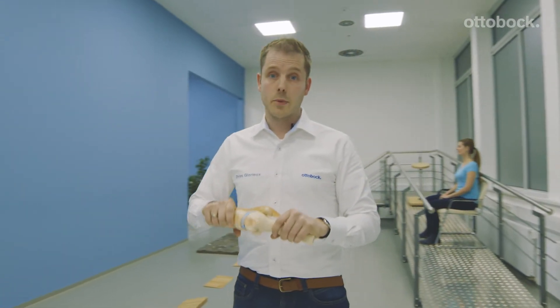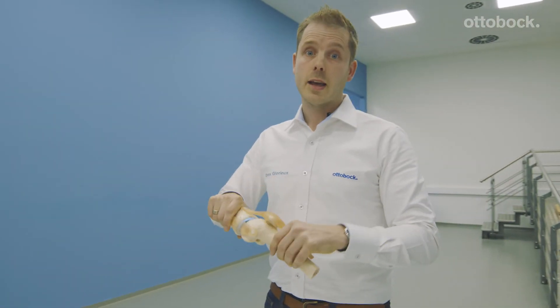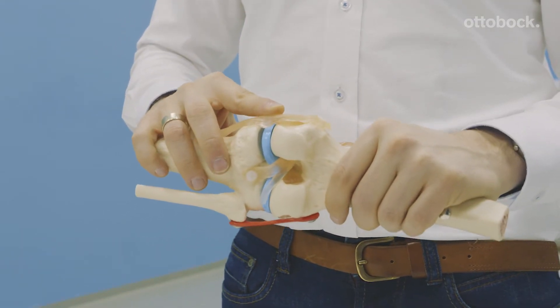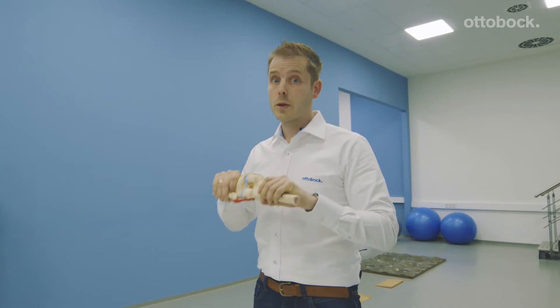The knee joint, for example, is really made to flex and to extend and to have some gentle forces. But if you have a negative force, it will have a negative impact over time. And that is something that we really don't want to have.